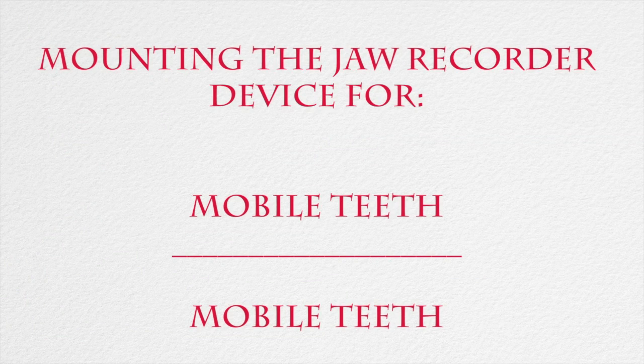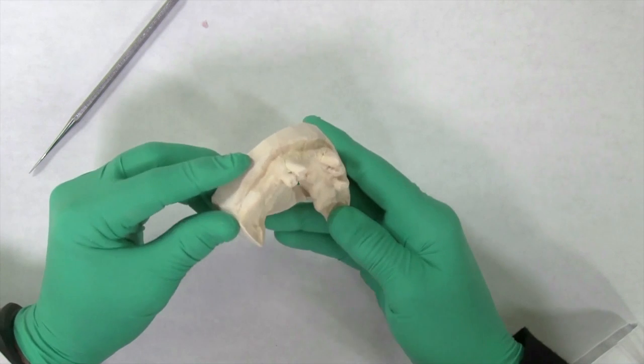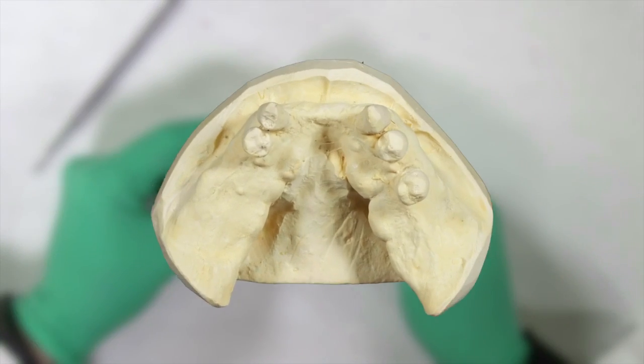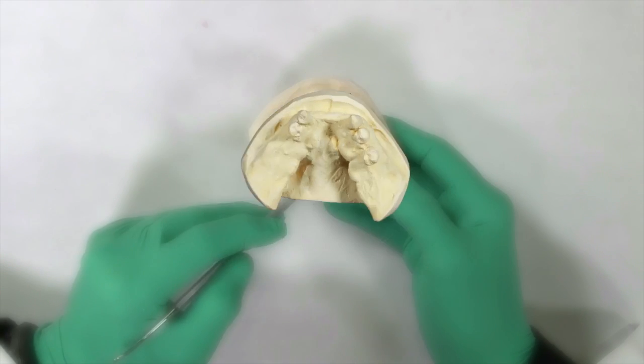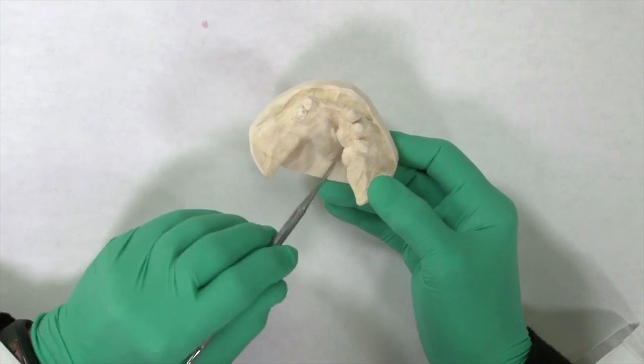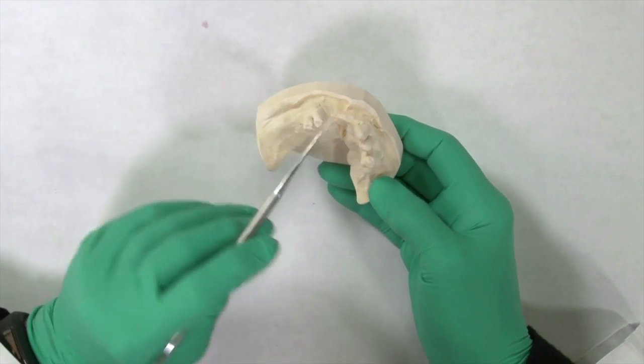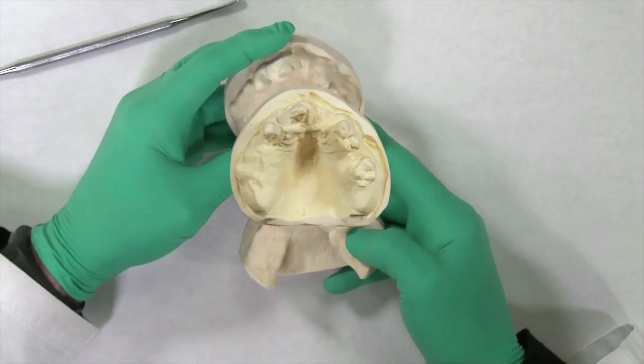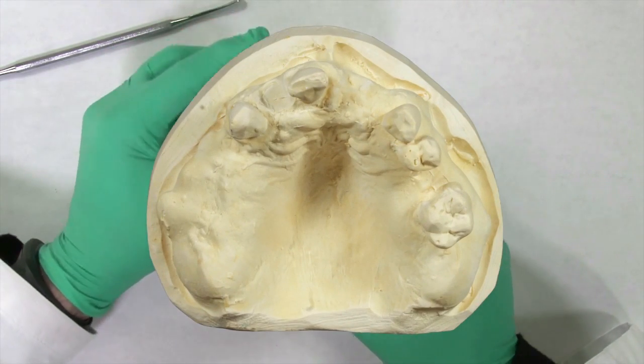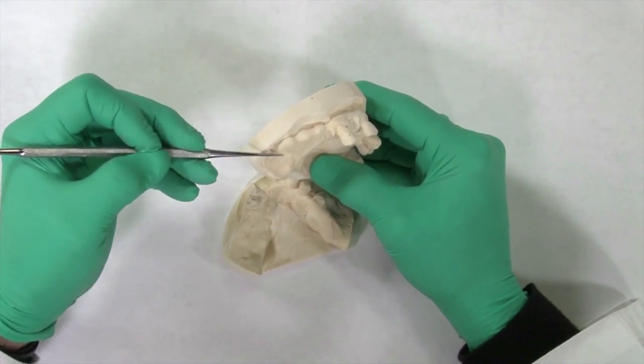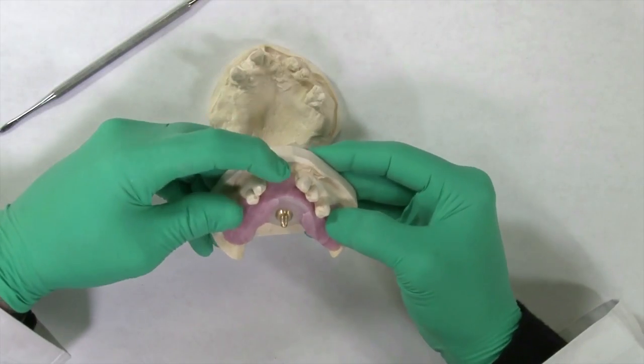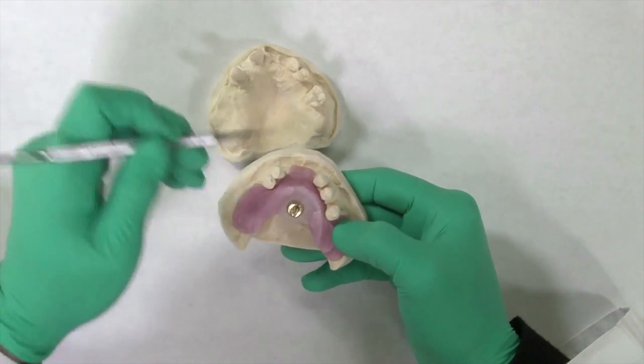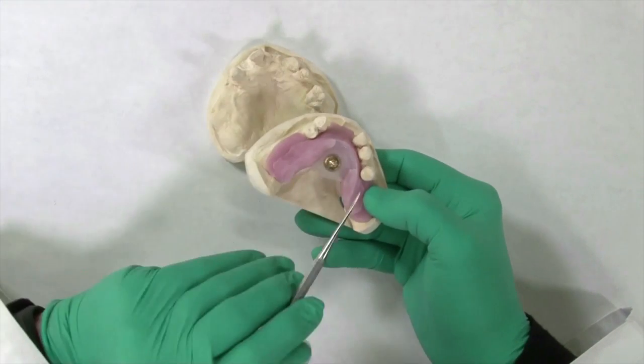Mounting the Mossad jaw recorder for mobile teeth. In this case, there is a partially edentulous mandibular arch with large tori and mobile teeth. It is virtually impossible to record a bite using conventional methods such as wax or bite registration materials, as the teeth will move when pressure is applied, and the mounting will be incorrect. On the maxillary arch, there are also mobile teeth combined with large tori. In these cases, a record base is fabricated with tissue stops in the edentulous areas for stability. A pin receiver is placed on the lower base plate, slightly below the occlusal plane.